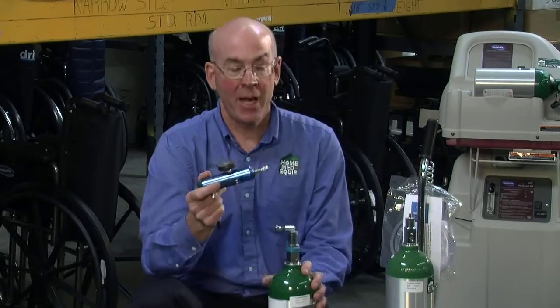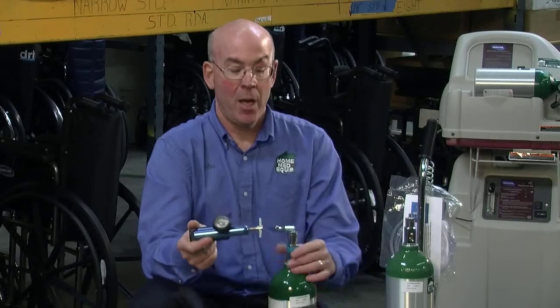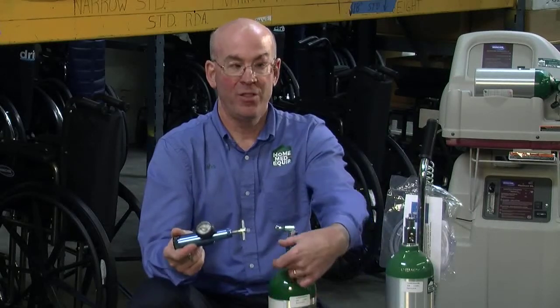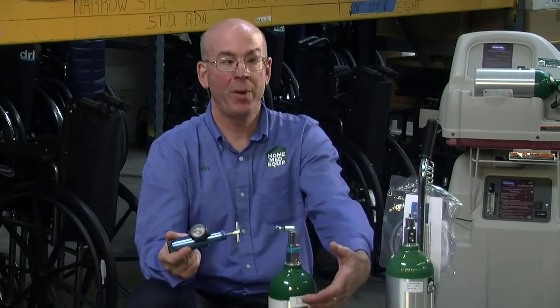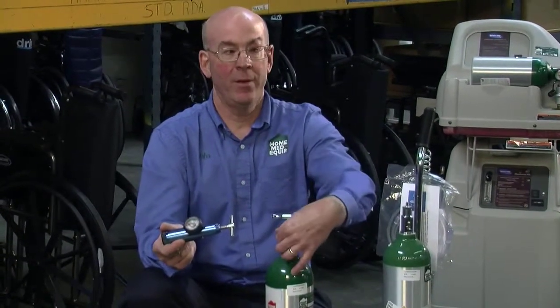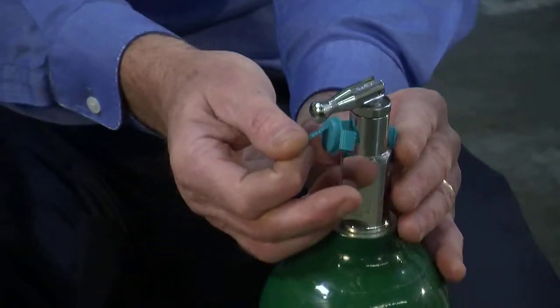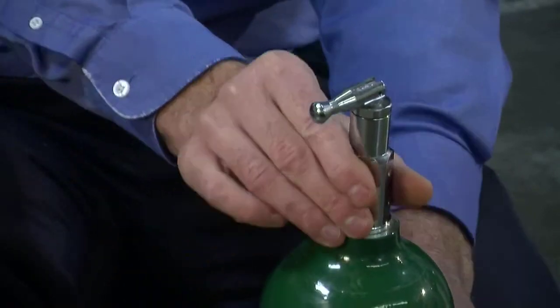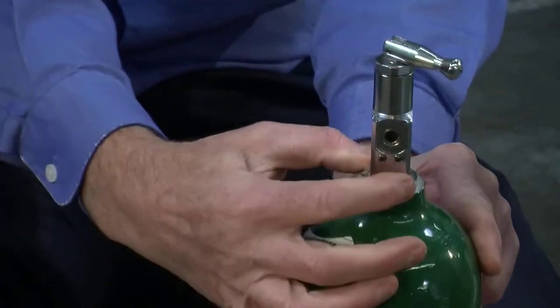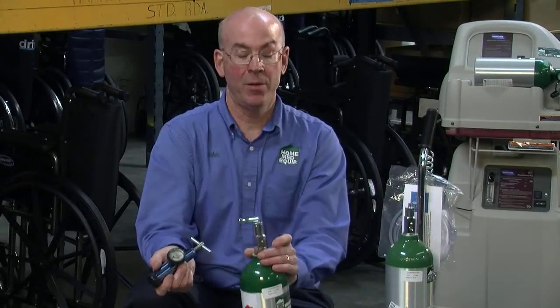To move to another tank, each tank has a dust cover protecting the cylinder opening from any dust or foreign objects. There's a little tab on the cover that you take and tear down, and when you do that you expose the hole where the oxygen will come out on the cylinder.